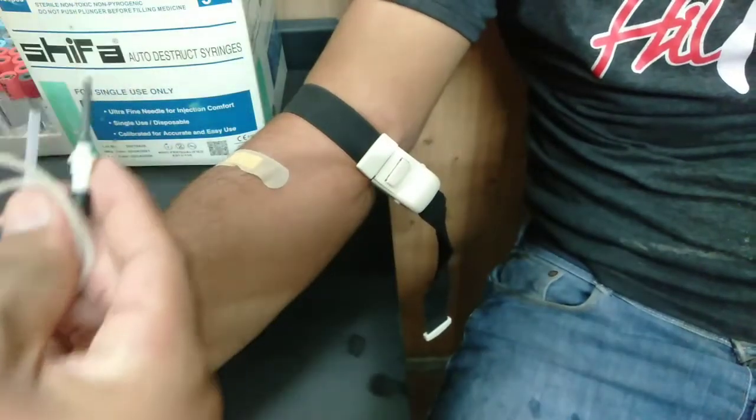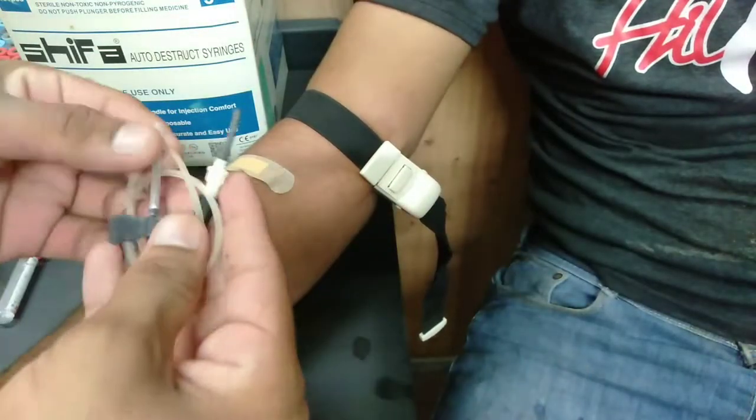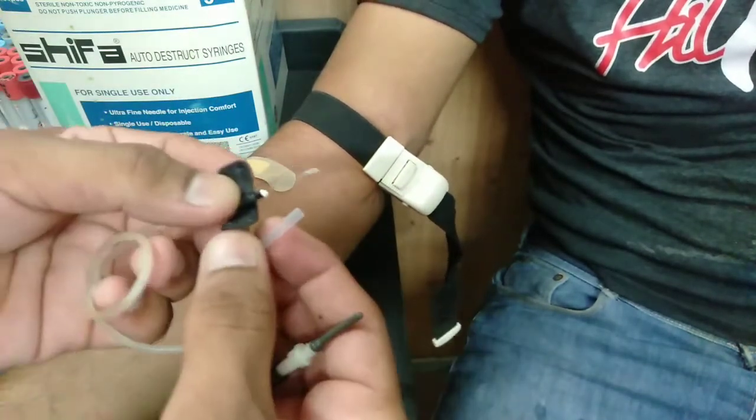If we use the butterfly needle to take the sample, we can also use that method. If we need a small vein, we are able to use the butterfly. We can take the sample the same way using the butterfly.